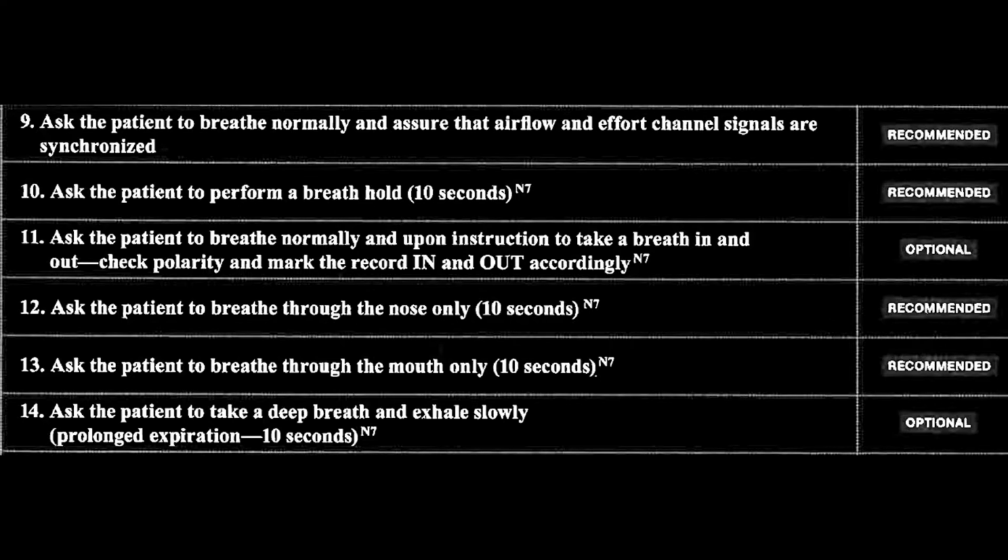As a rule of thumb, anything you think may cause confusion when reading a polysomnogram, if it were to happen during the recording, you should have the patient do before the recording. When you put the cables on, and just before lights out, you should ask the patient to do as many things as you think the patient will do during the recording, and you may find difficulty interpreting them.